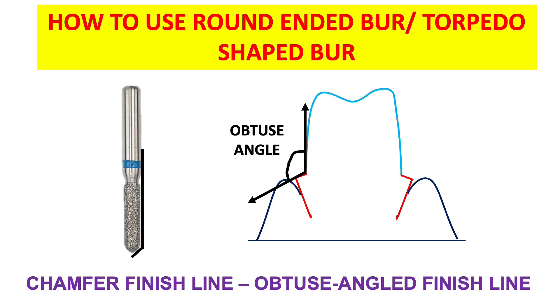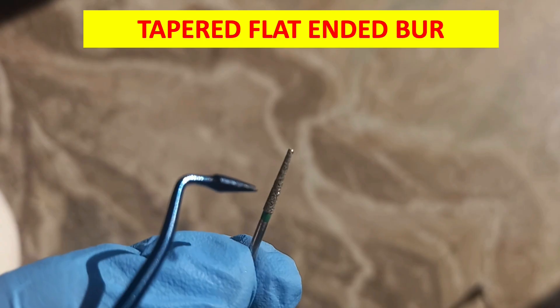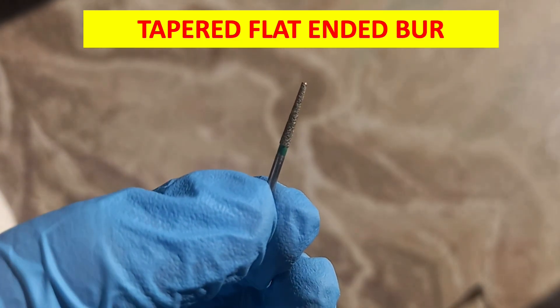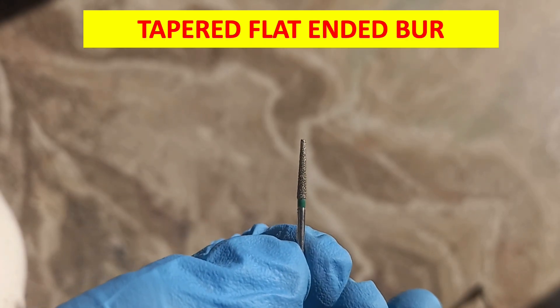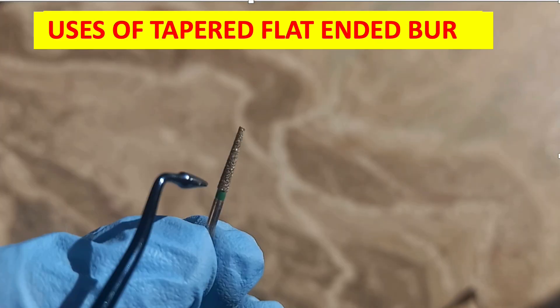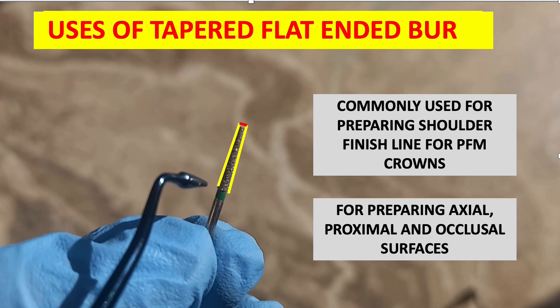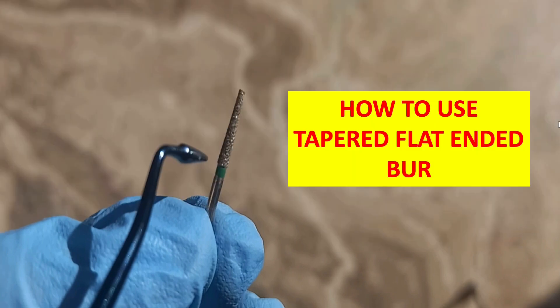Next, we have the tapered flat-ended bur. As you can see in the figure, the bur has a tapered shank and a flat end — that is why it is called the tapered flat-ended bur. It is basically used for the shoulder finish line preparation in the case of PFM. The tapered flat-ended bur is commonly used for preparing the shoulder finish line for PFM crowns, and for preparing the axial, proximal, and occlusal surfaces. The lingual surface is prepared by the round-ended or torpedo shaped bur.